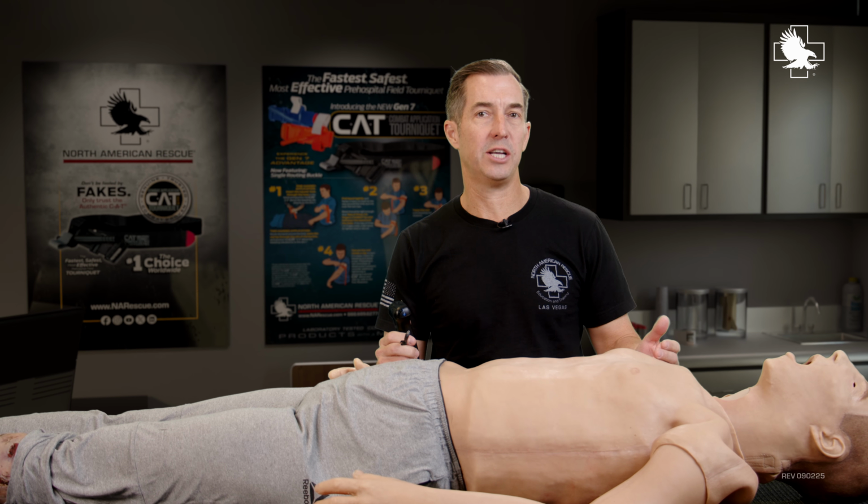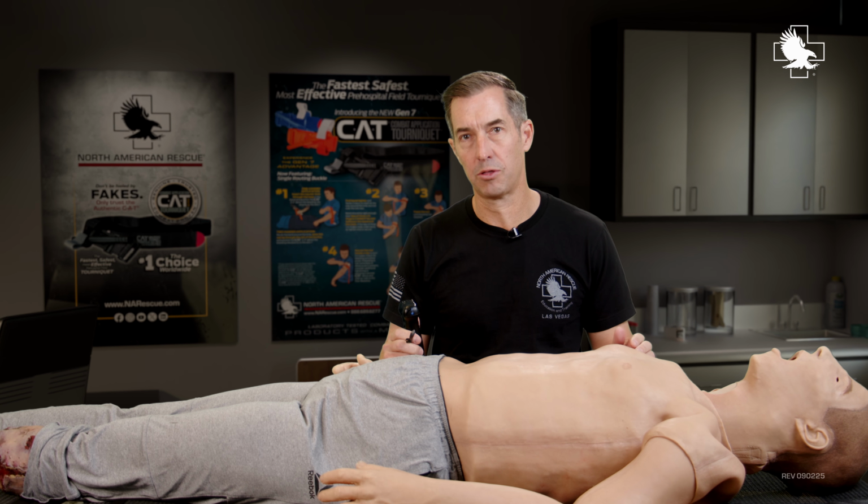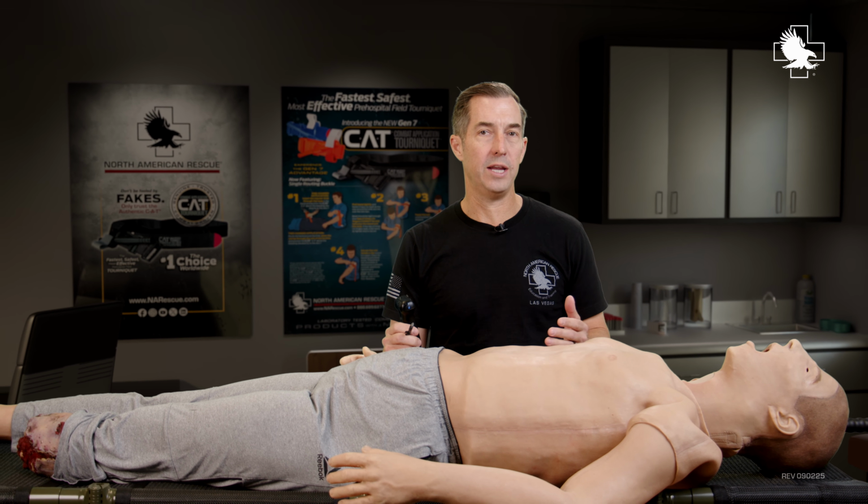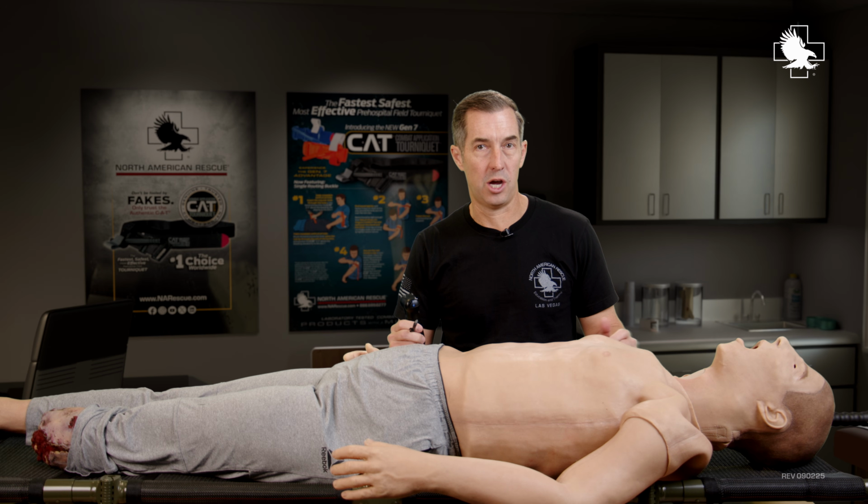Is my patient crashing because they've got a tension pneumothorax, or is it because they've got hemorrhagic shock? Well, we want to do the right treatment for the right problem. So if we don't need to needle decompress the chest, then there's no reason to. Let's get on with resuscitation for hemorrhagic shock, right?